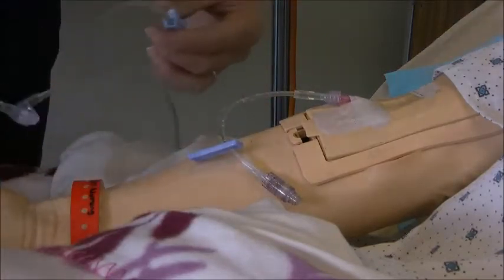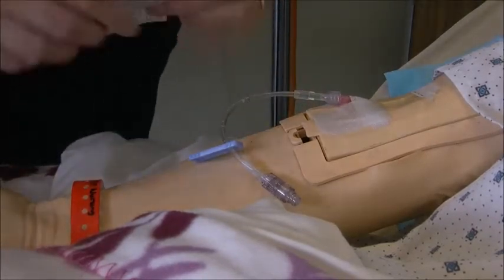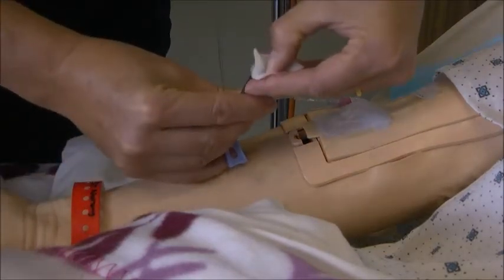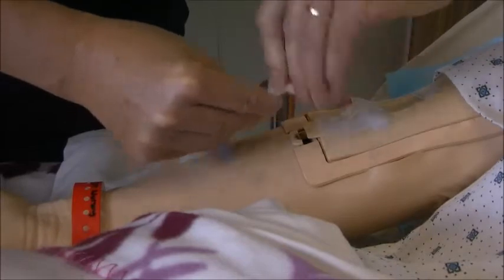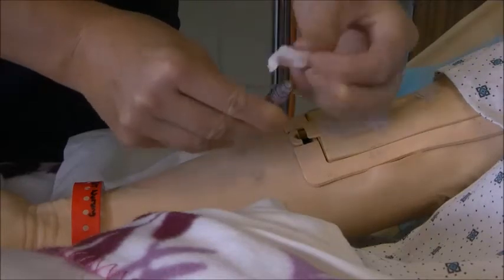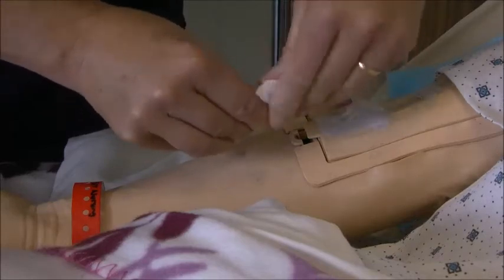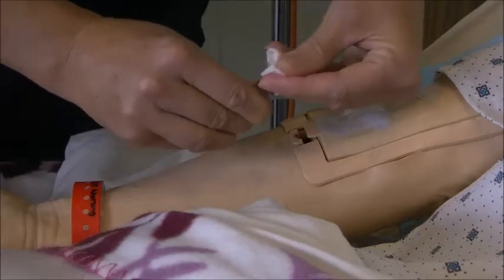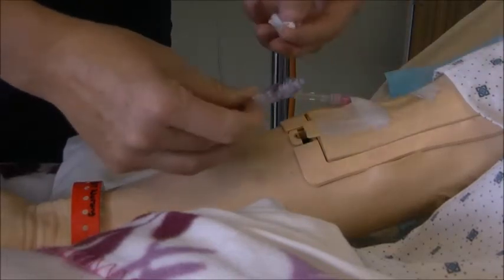So when you're connecting your IV tubing, you need to scrub the hub. So you get your alcohol wipe, and it's this part here that you want to give a really good scrub. So making sure that you spend at least 15 seconds doing that, and putting a bit of friction on there. So don't be gentle about this, make sure you give it a really good scrub. Okay, now I'm going to let that dry.